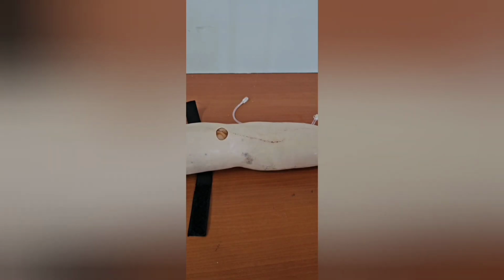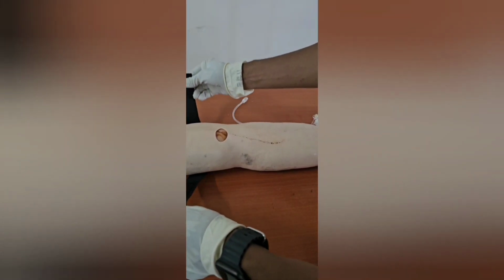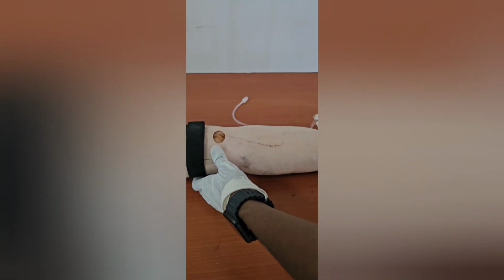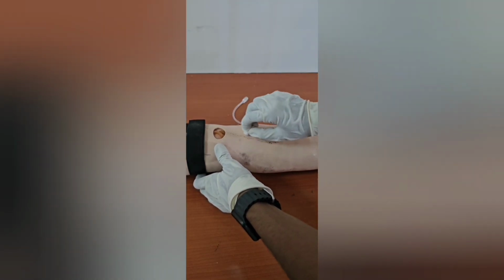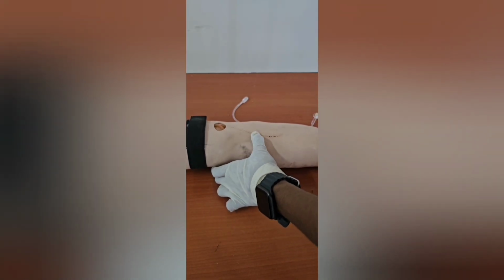Once that is done, we need to choose the appropriate vein in this site to be injected. Then tie the tourniquet. Here we are using the cubital fossa for convenience. In an actual patient, we will use the dorsum of the hand. Then disinfect the skin over the vein with sterile cotton soaked in spirit. Stabilize the vein by pulling skin taut in longitudinal direction by the non-dominant hand.